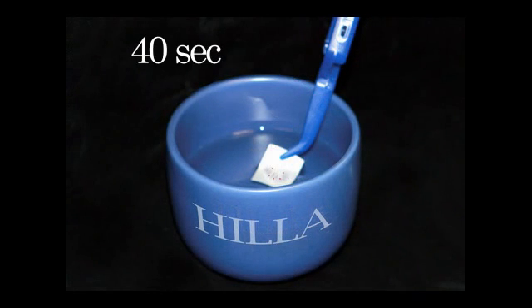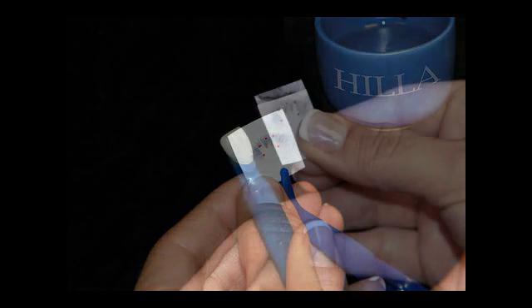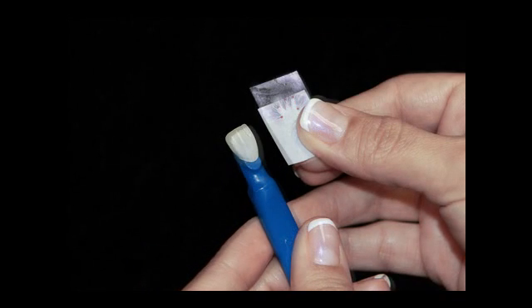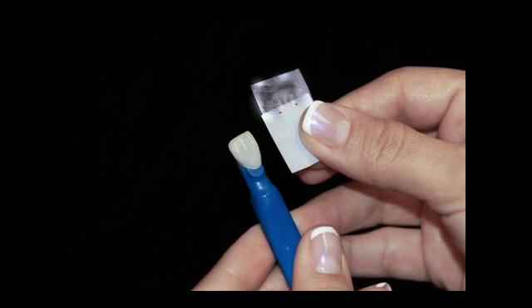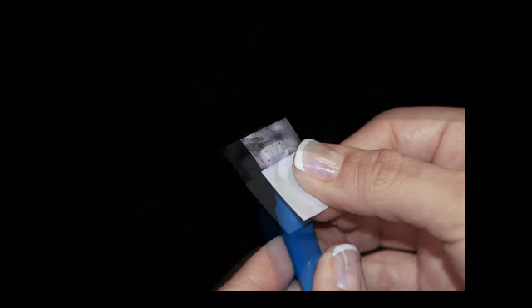Place the transfer in tap water at room temperature for approximately 40 seconds. Then place the transfer between the thumb and index finger, slowly slide the backing from the transfer onto the restoration, and line up the dots.